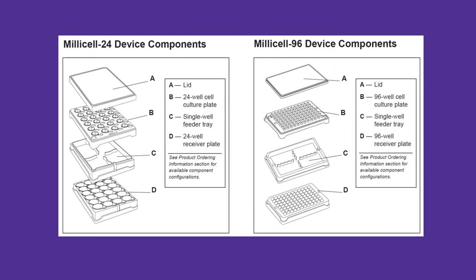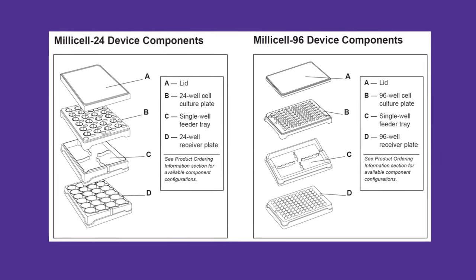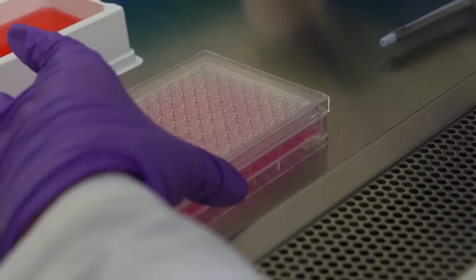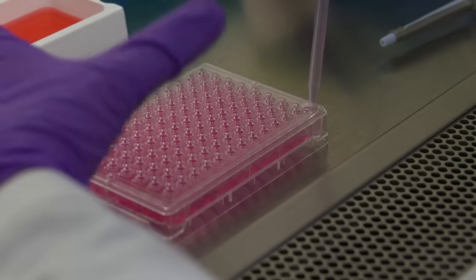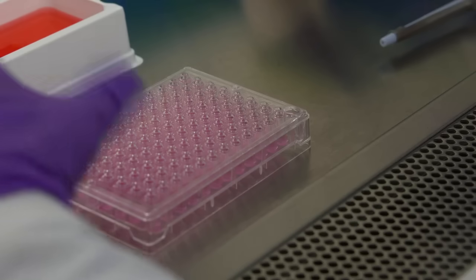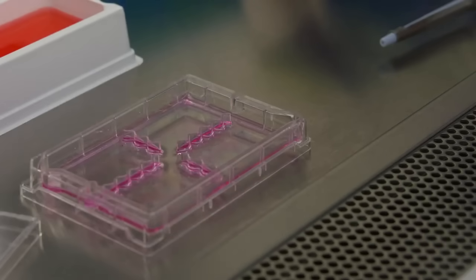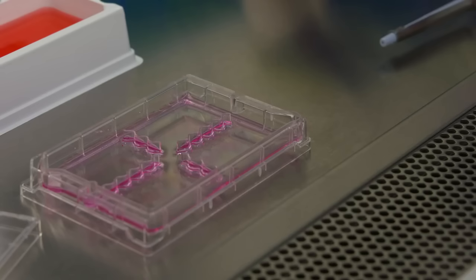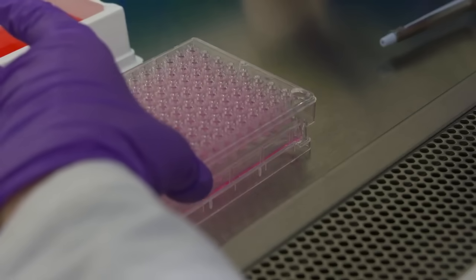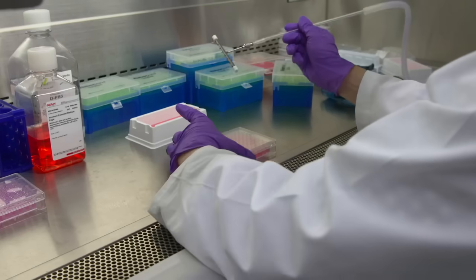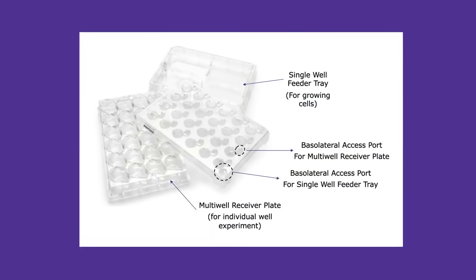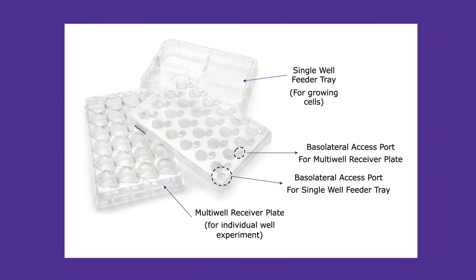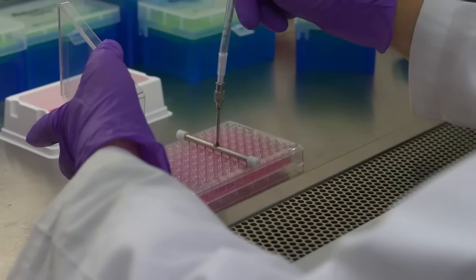As you can see, these come in either 24 or 96 well format. Let me show you the individual components. Once you remove the cover you will see the filter plate itself with its associated basolateral access port to the side. Underneath it you will find the receiver plate, which comes in two flavors. One is a single well feeder tray which enables all the wells to be fed from one type of media present in the basolateral media — usually used for initial culturing of the cells. The other is a multi-well receiver plate which enables individualized treatment of each well, just like a regular multi-well plate, and is typically used for the actual assay where different wells need to be treated differently.